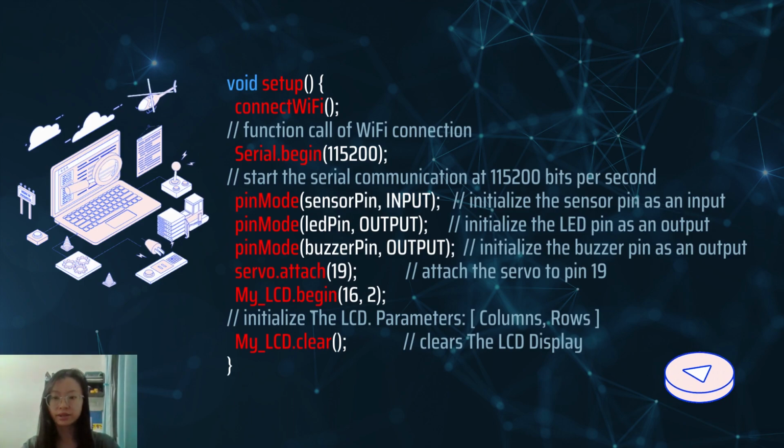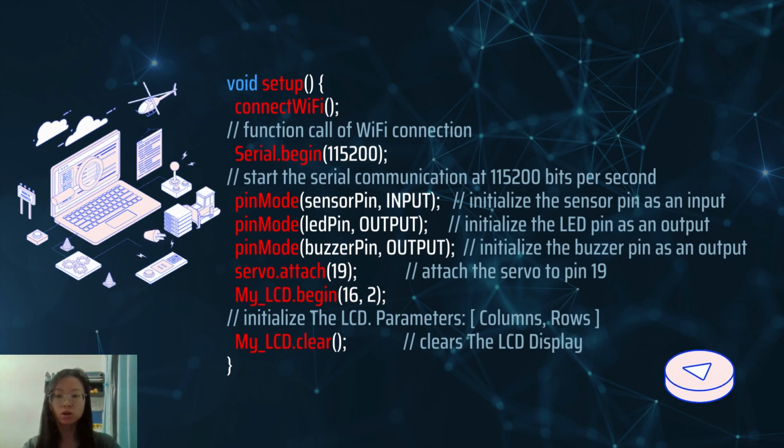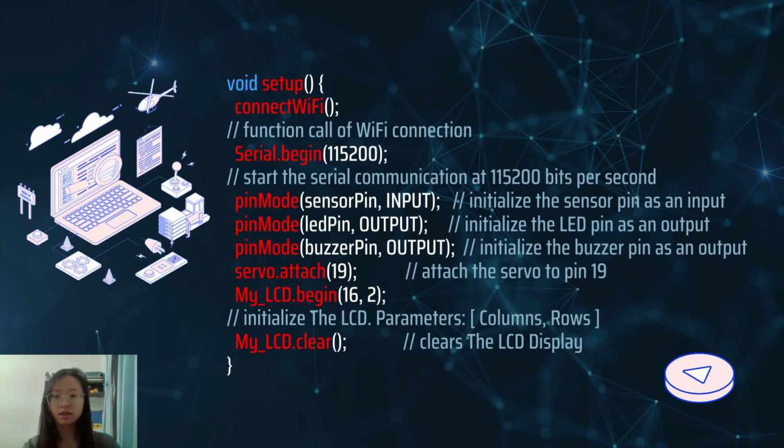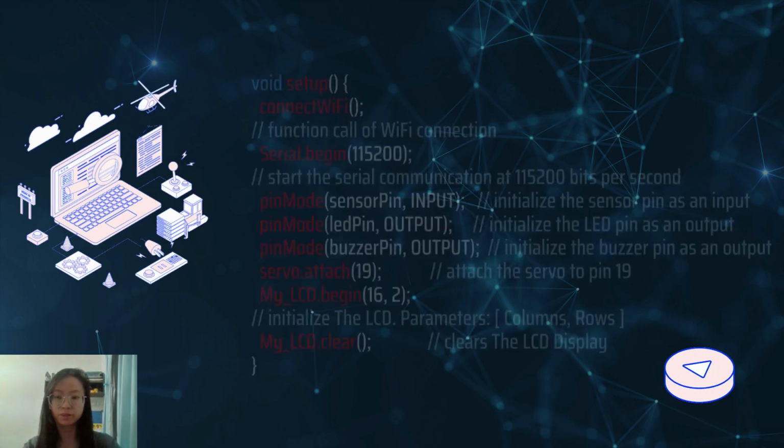Next, servo.attach(19) attaches a servo motor to pin 19 of the ESP32. The line myLCD(16, 2) initializes the LCD display with 16 columns and 2 rows. Finally, myLCD.clear is called to clear the LCD display.